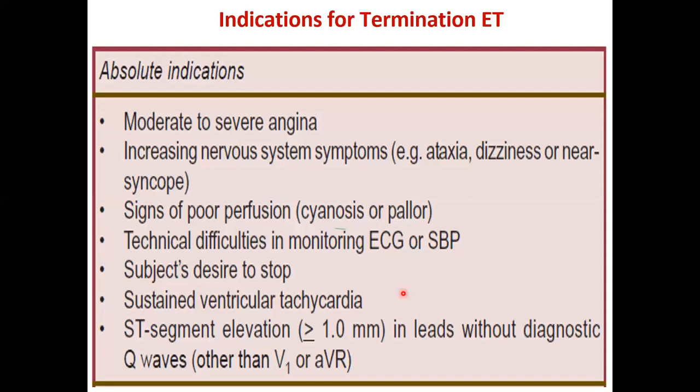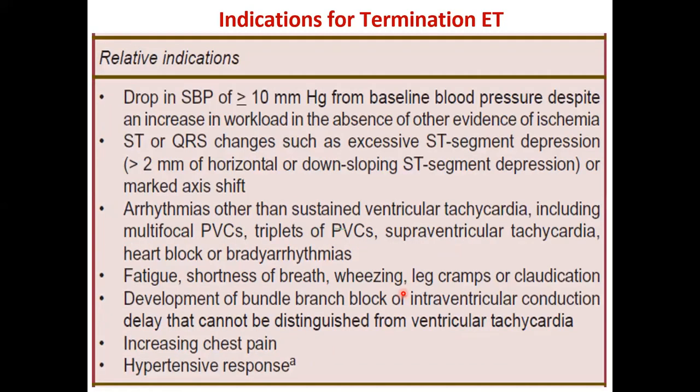One, when there is moderate to severe angina, increasing nervous system symptoms like ataxia, dizziness, or near syncope, or there are signs of poor perfusion, such as cyanosis or pallor, or you begin to have some technical difficulties in monitoring either the ECG or the systolic blood pressure. That is an indication for you to stop that stress test at that point in time. Or the subject has indicated his desire to stop, or you begin to have sustained ventricular tachycardia, or there's an ST segment elevation greater than 1 millimeter in leads without diagnostic Q waves other than lead V1 and aVR.